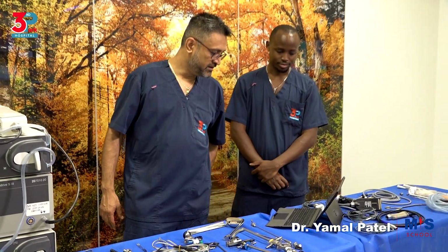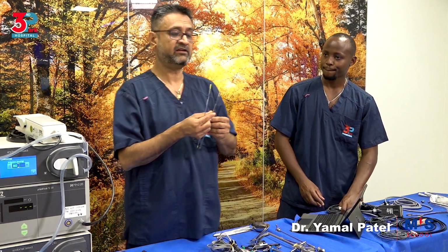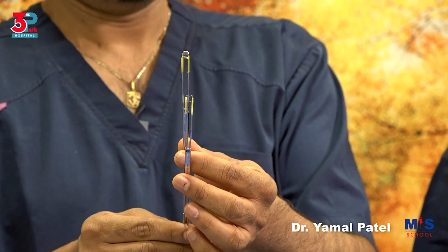So let's move on. When we talk of the electrodes that can be attached to it, we have different electrodes. So we have this, which is a loop, as you can see there, if you can look closely. We have a roller ball.